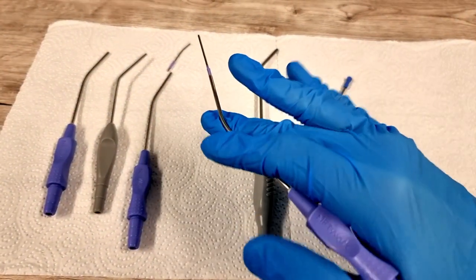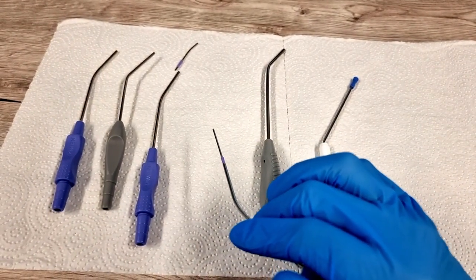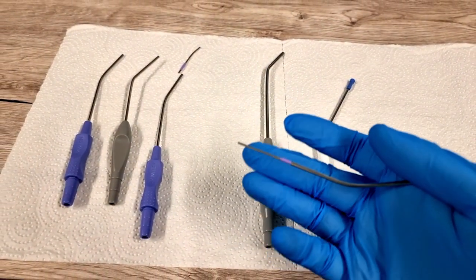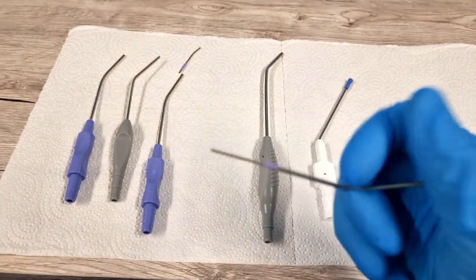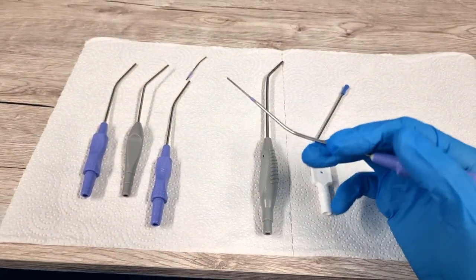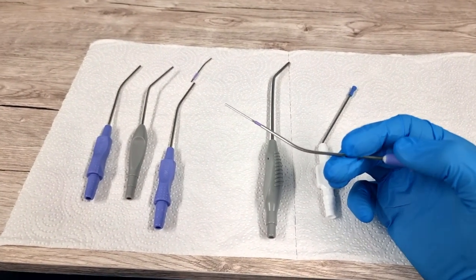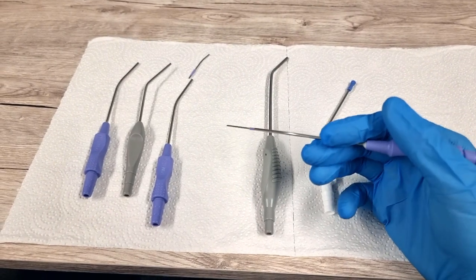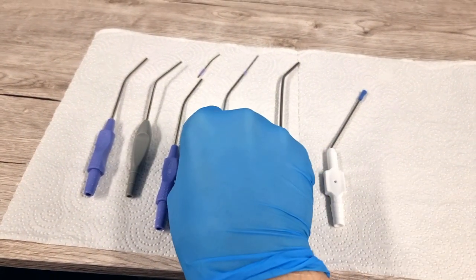Immediately I can tell you that this is way too long. The fine end really needs to be shorter. I need to find a new supplier, because this fine end is just unmanageably long. But the idea with the fine end is that it's smaller, so it's less likely to cause trauma. It's quieter, and it gives you a bit more control when you're suctioning down near the eardrum. So here we go, fine ends, bent and straight.